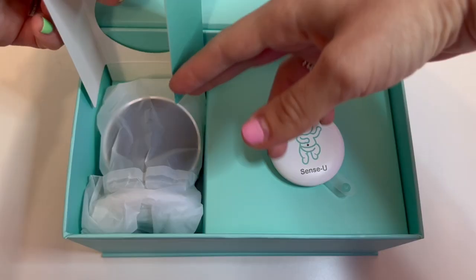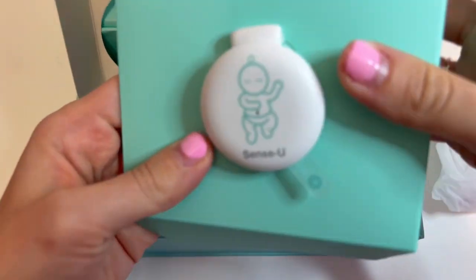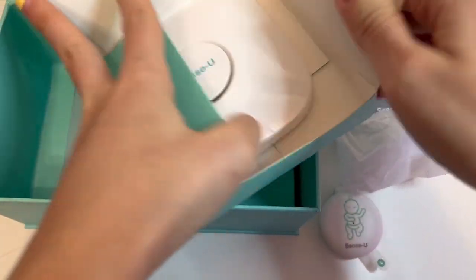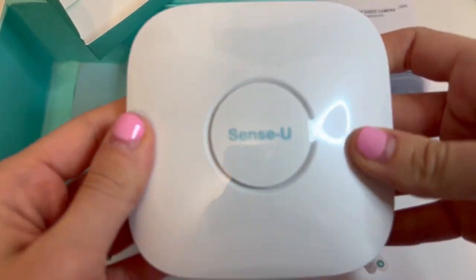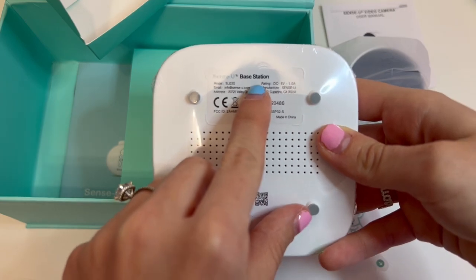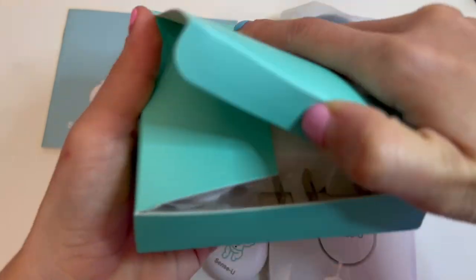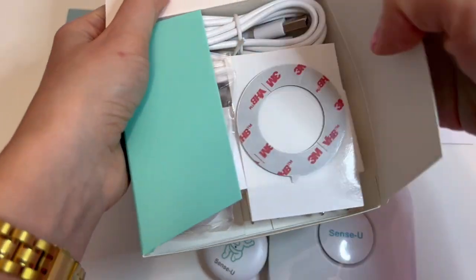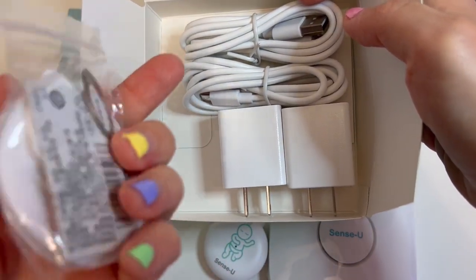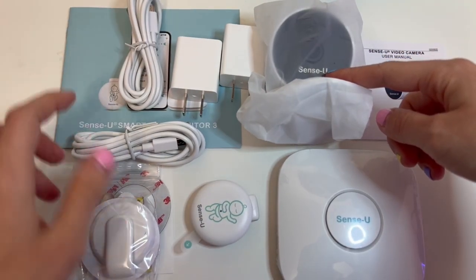When you open the box, you'll see the camera in a nice little wrapping, and then you'll also see the little SenseU monitor device. This also has the user manual, and it comes with the base station. Those two devices — that little circle and the base station — work together, and this is what tracks the baby's movement, the temperature, and all that good stuff. The user manual is also included, and then you get a box of all these little goodies: the mounting thing for the camera, extra stuff for the baby monitor, and cords so you can get power to these devices.